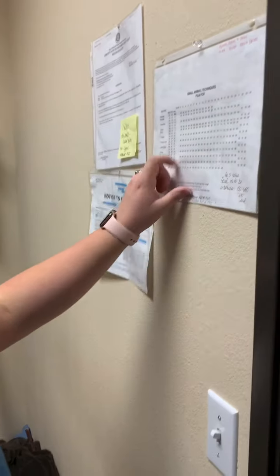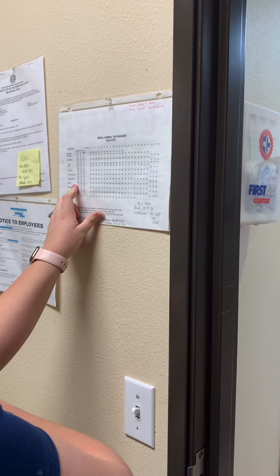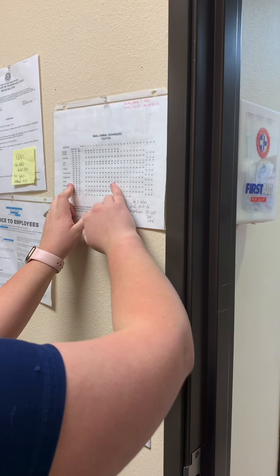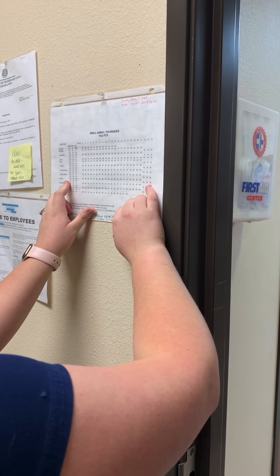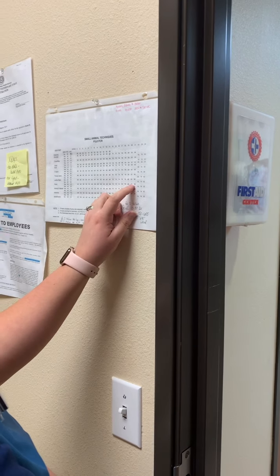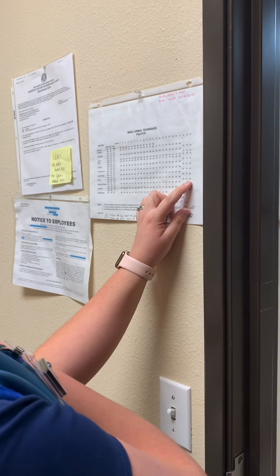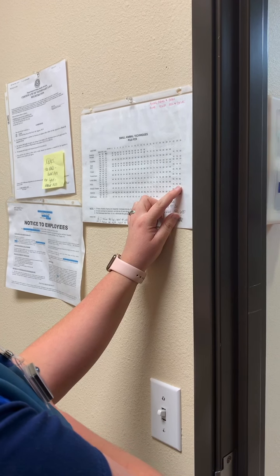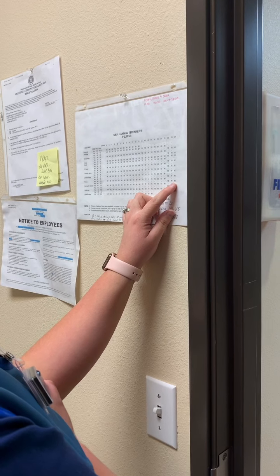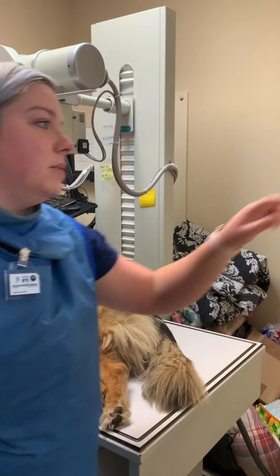So you find pelvis, and our technique chart doesn't go to 26, but you can add on to it because it's going up by 3. So it would be 88. Okay, so it will be 88 for the KVP and 10 for the MAs.